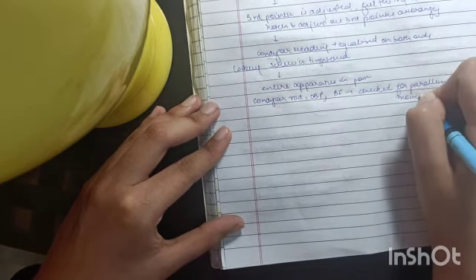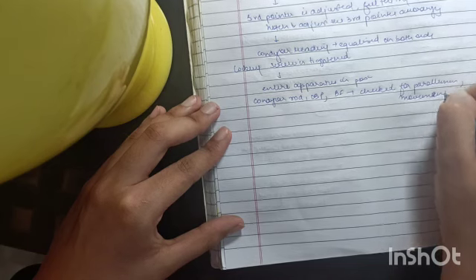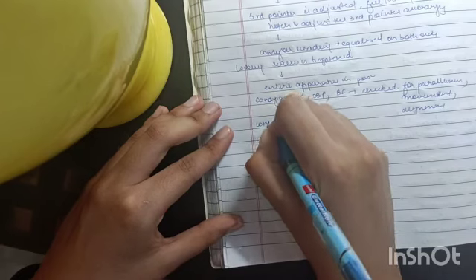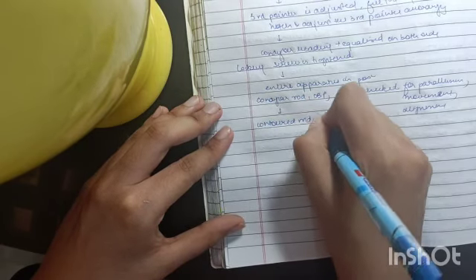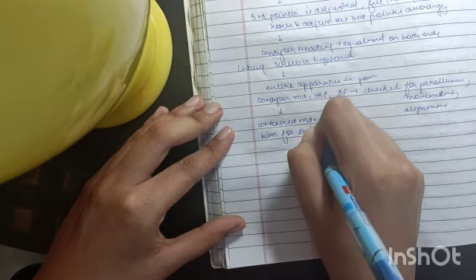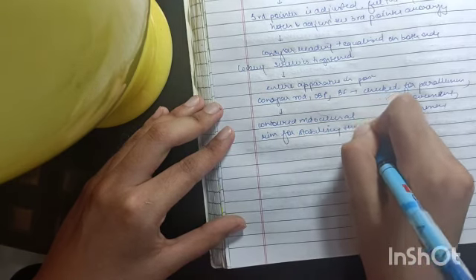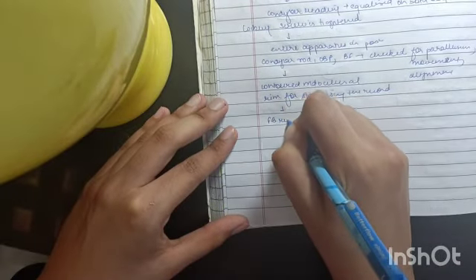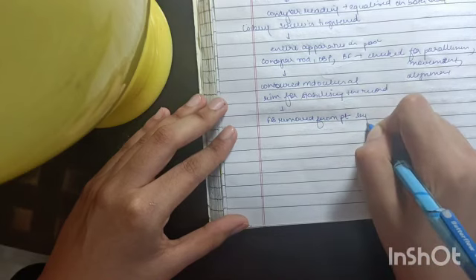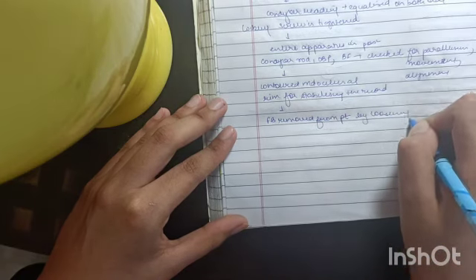movement, and alignment. Now we can also use the contoured mandibular occlusal rim for stabilizing the record. Then the face bow is removed from the patient by loosening the screw.